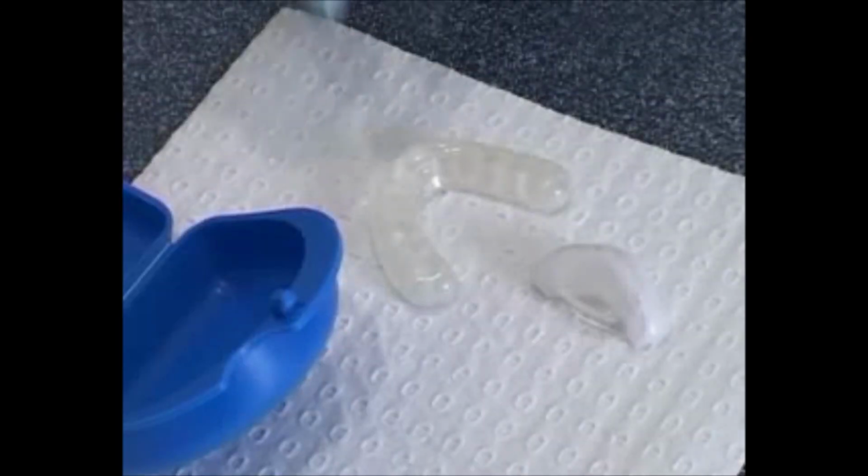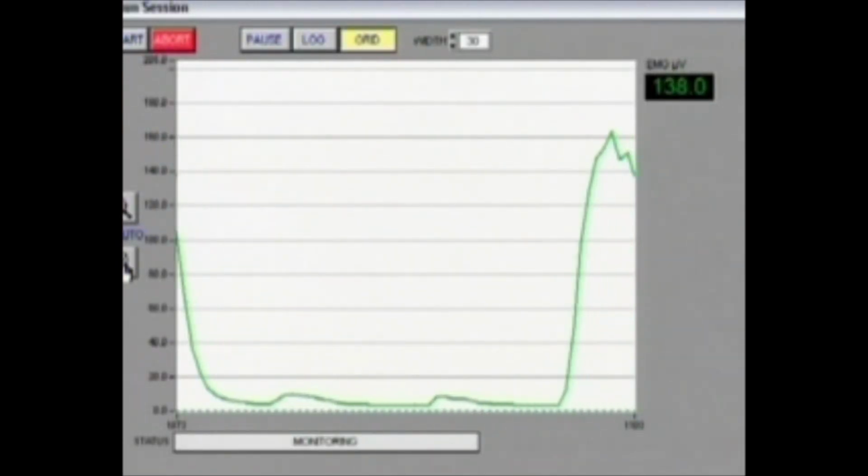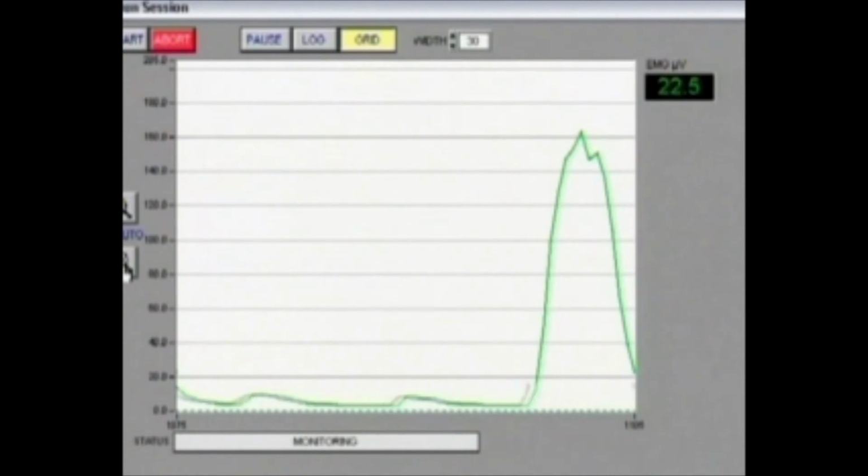And it'd be interesting now to check the full mouth splint. So this is the full mouth splint that Belinda has worn for quite some time. I think it's about 1.5 years. So I'll let you pop it in. That's the way. And just nice and relaxed. And now I'll get you to clench as hard as you can on that splint. So all the teeth are touching that splint. You can see Belinda's getting up to about I think peaked at just over 160, 163, and nice and relaxed again.